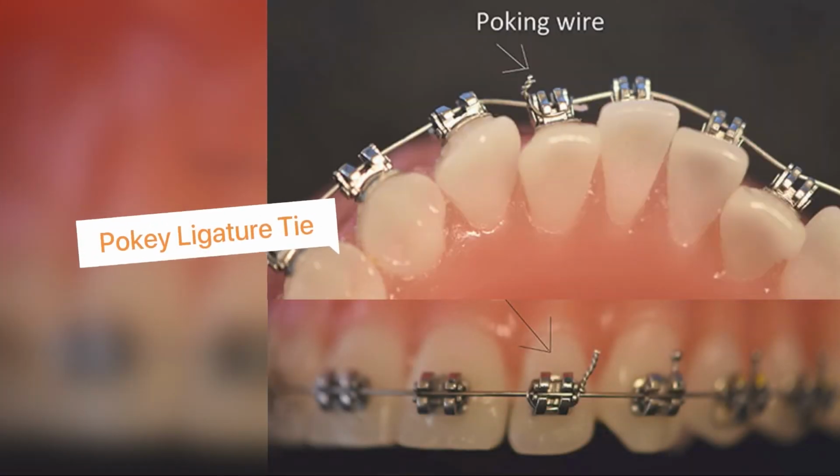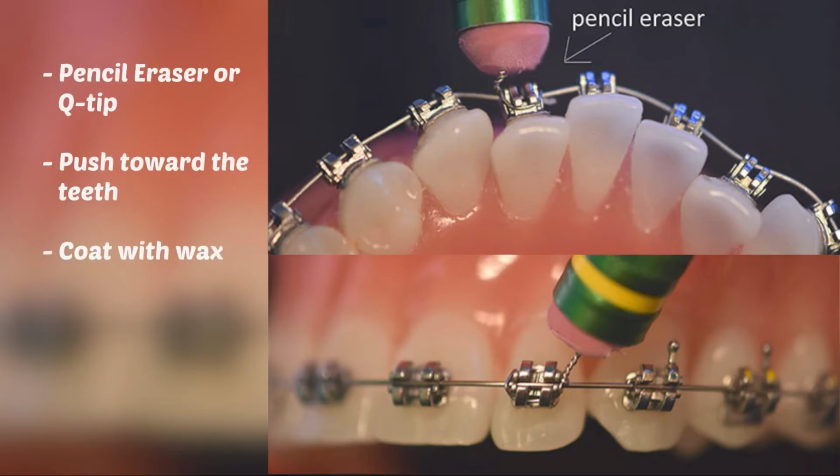If it's one of the metal ligature ties that is poking you, simply push it towards your teeth, away from your lips and cheeks, using a pencil eraser or a Q-tip. You can also place some wax to cover it.